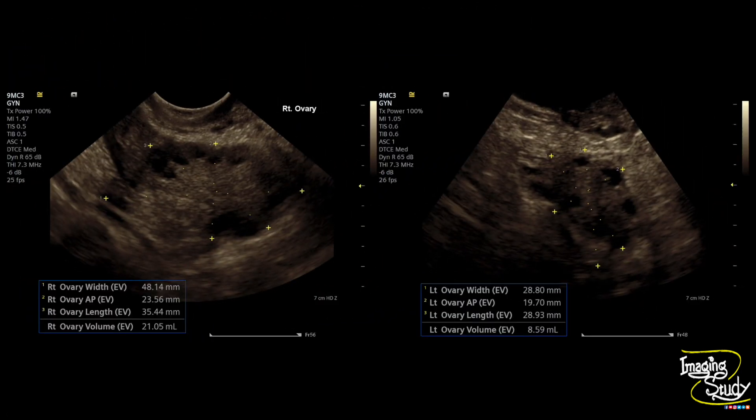In this patient, one ovary shows 21 cc volume and the other 8.6 cc, so there is enlargement but it is disproportionate. The main factor causing this confusion is possibly the treatment — this patient is receiving long-term treatment for polycystic ovarian disease. When a patient is on treatment, not all the textbook features may be present, so expect some variations.